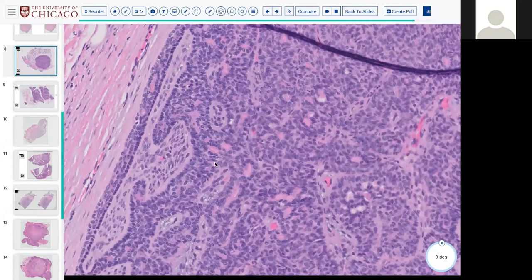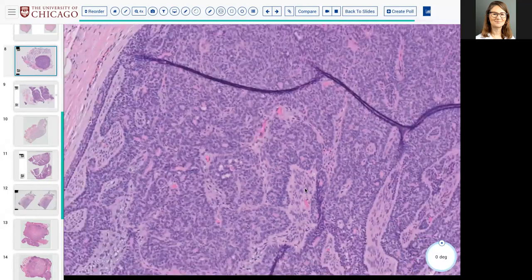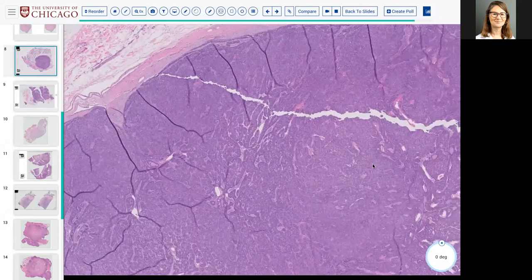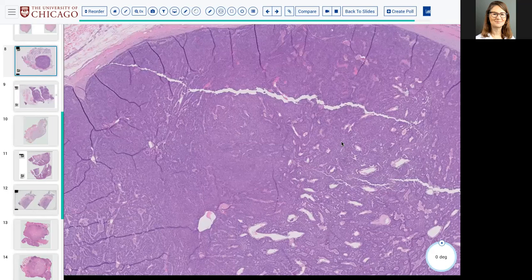Beta-cat, yeah, exactly. So it should stain the nuclei of at least a subset of tumor cells in basal cell adenomas, which really doesn't occur in other salivary type neoplasms. So Christy, what is S100?